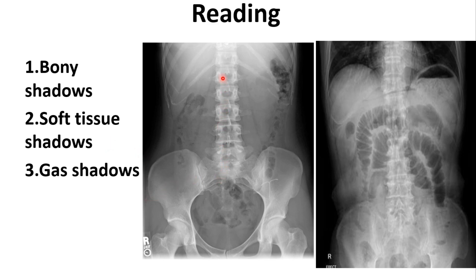After the bony shadow, look for soft tissue shadows. The first soft tissue shadow lies lateral to the lumbar vertebrae — this is the psoas major muscle. You can see the darker outline on the right and left sides representing the lateral border of the psoas major muscle. Another soft tissue shadow visible, if the X-ray is taken at a higher level including the lower thoracic cage, is the dome of the diaphragm — the left dome and the right dome.